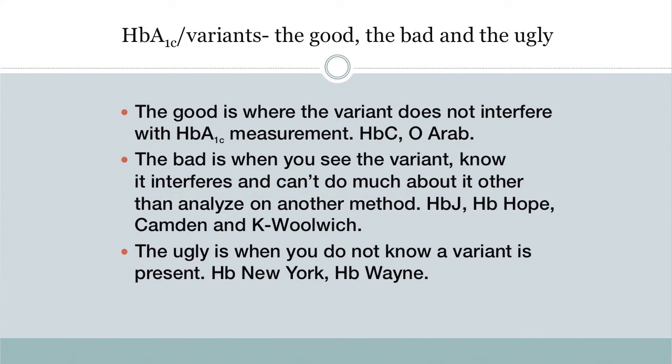Let's look at hemoglobin variants: the good, the bad, and the ugly. The good is where the variant does not interfere with A1c measurements — typical of hemoglobin C and hemoglobin O Arab. The bad is when you can see the variant, know it interferes, but can't do much about it — hemoglobin J, hemoglobin Hull, hemoglobin Camden, and hemoglobin K Woolwich. The ugly is when you do not know a variant is present, such as hemoglobin New York or hemoglobin Wayne, which we discussed earlier.